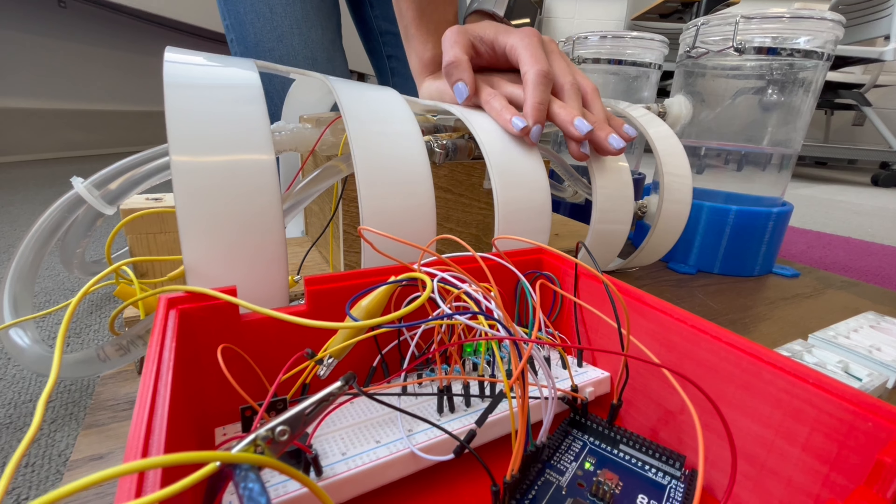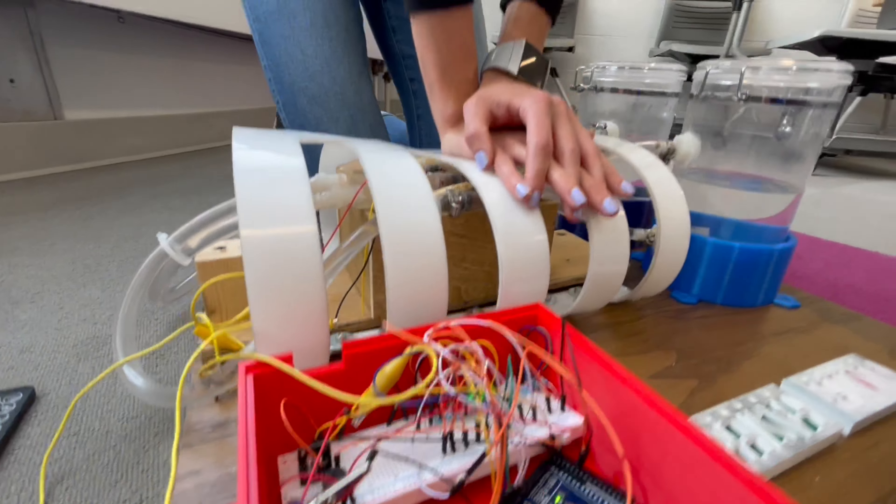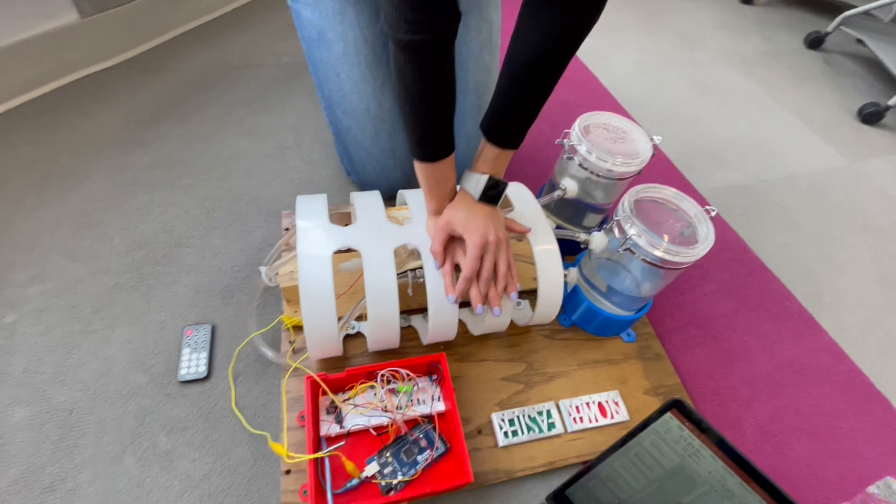Pay attention to the LED lights illuminating, as the ribcage is compressed deeper the line of strip lights does as well. The green lights indicate the ideal range.